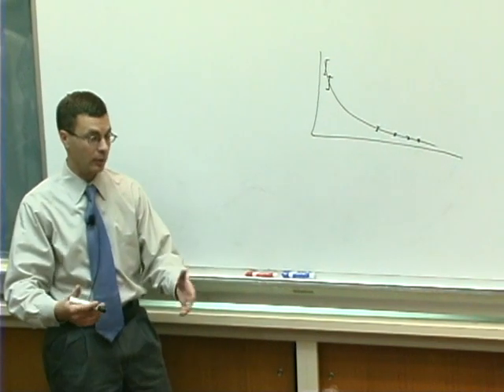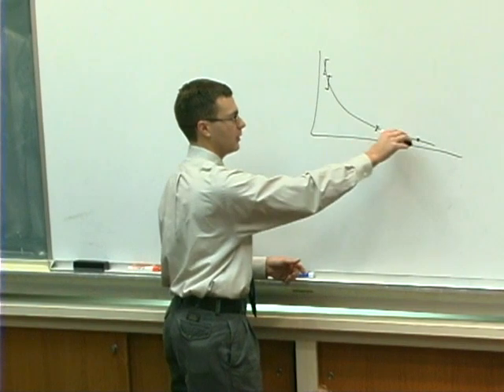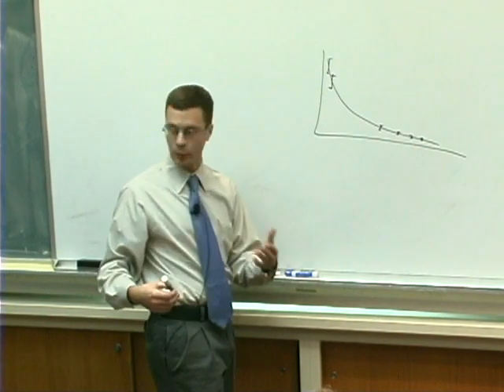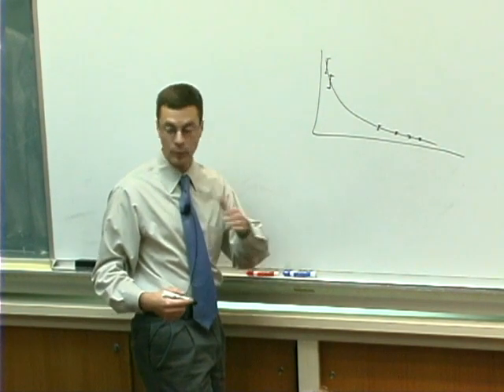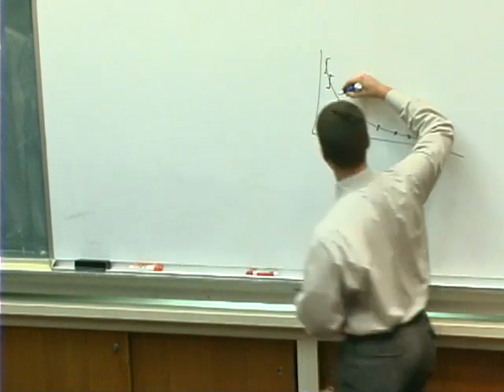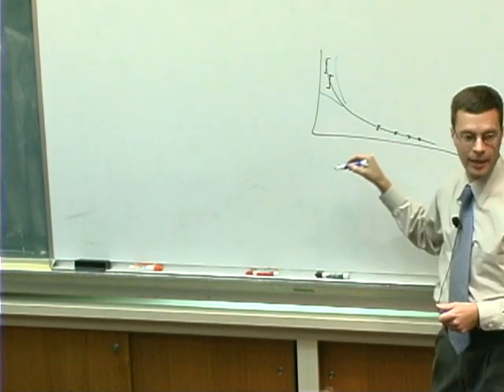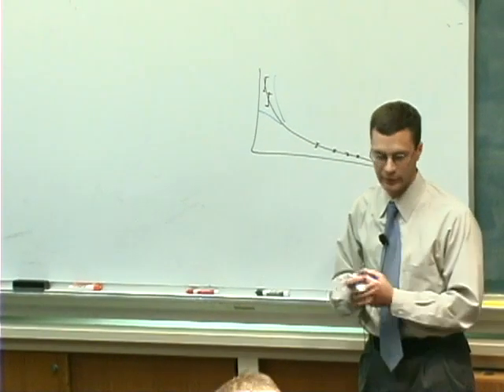But as you'll recall, one thing I mentioned, a flaw of this approach is that by making the assumption that this is the shape of the noise across all of our analyses, we're going to be systematically wrong in that a lot of the voxels are going to have different patterns of noise from what we assume. Okay? And specifically, different voxels will have higher and lower low frequency noise just systematically. There's a lot more variability from voxel to voxel in how much noise there is at these low frequencies.